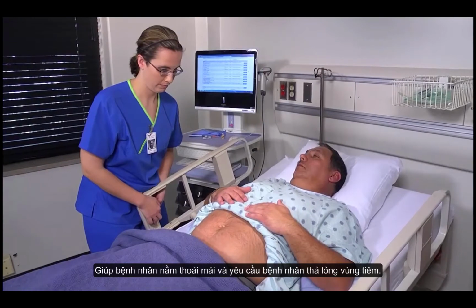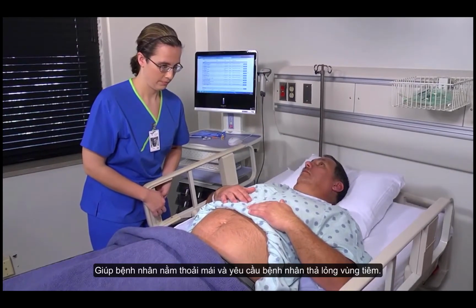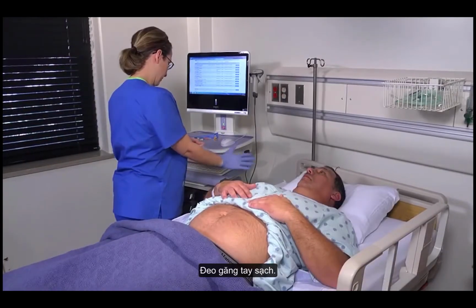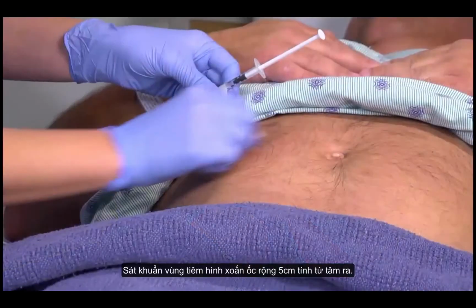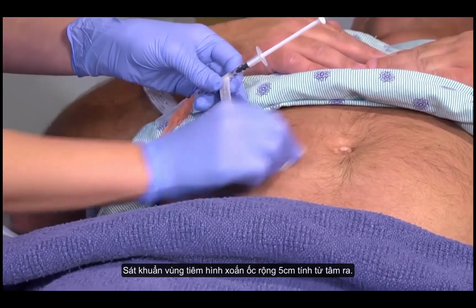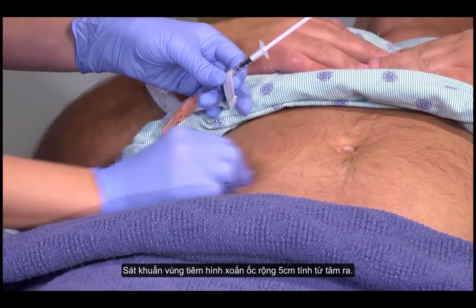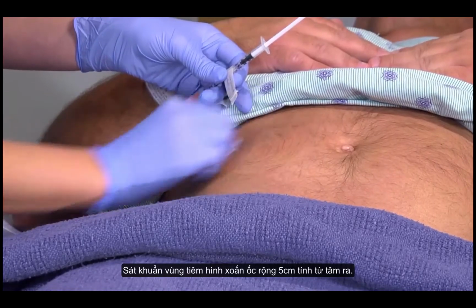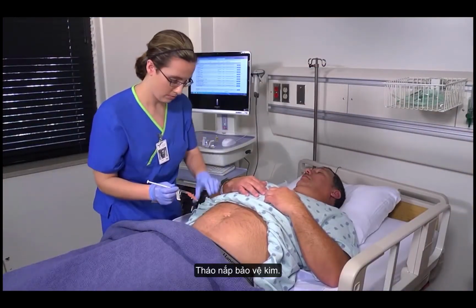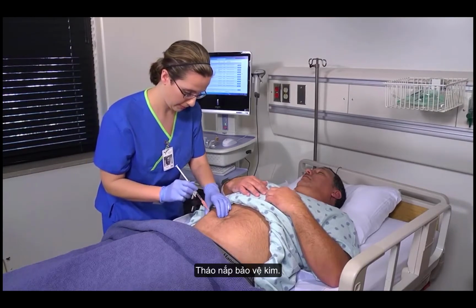Help the patient find a comfortable position and ask him to relax the area you're about to inject. Apply clean gloves. Clean the site with an antiseptic swab. Remember to begin at the center and move out in a 2-inch radius, cleaning in a circular pattern. Remove the needle cap or protective sheath on the syringe by pulling it straight off.